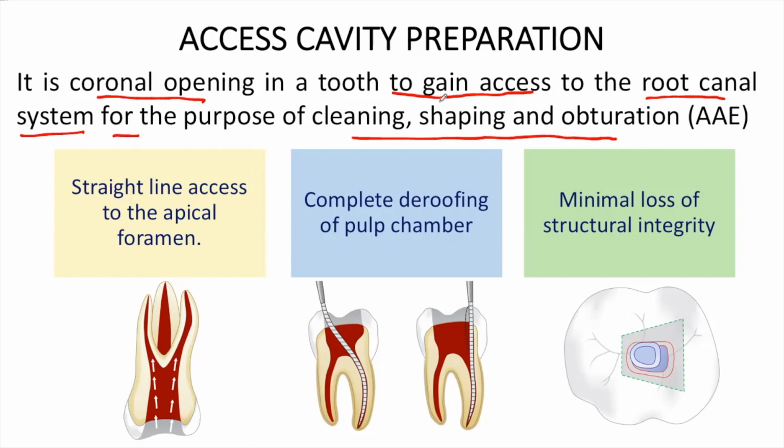Simple. So, basically, access cavity preparation is the coronal opening or coronal preparation so as to gain access to the root canal system for the purpose of cleaning, shaping, and obturation. So let's see what are the objectives of access cavity preparation.